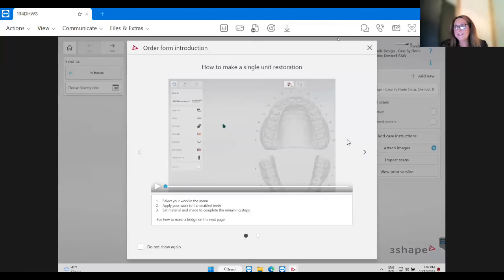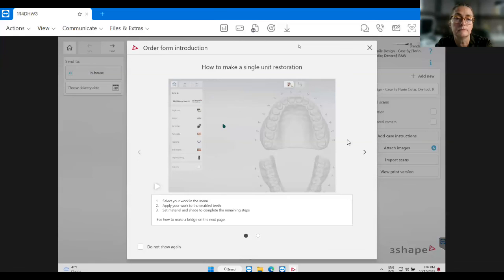And what's nice about this, if you have everything set up, like if the patient had veneers before and they have some rotations, you can always send this to the lab for a mock-up. Then you can also do almost like a functional PMMA try-in for them. So the patient can take it home. Yeah, we see requests for that, and we have to be more careful. Yeah, for sure.